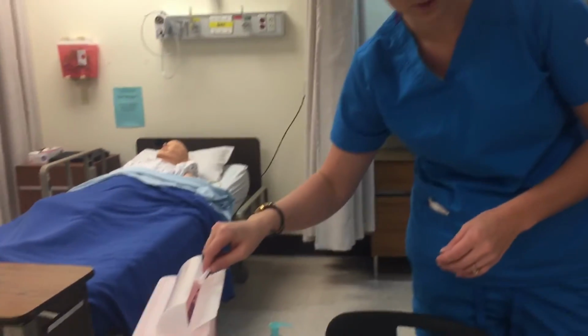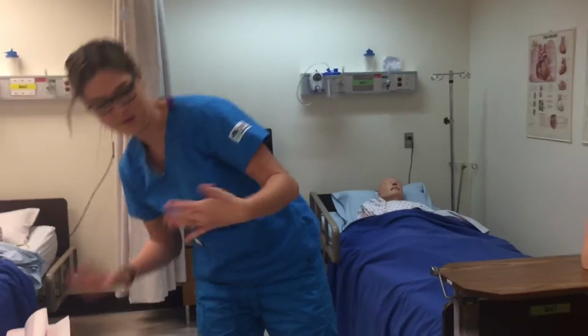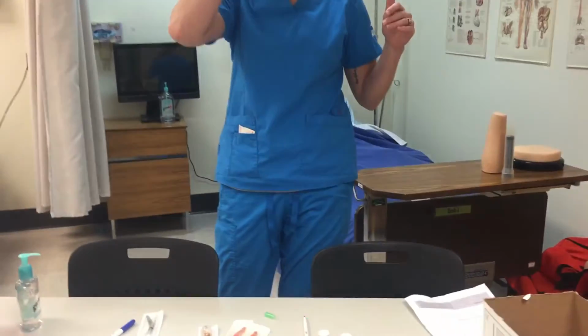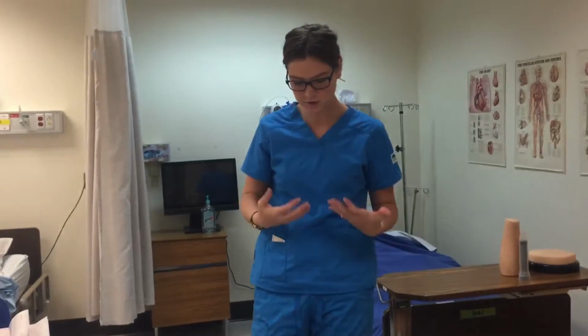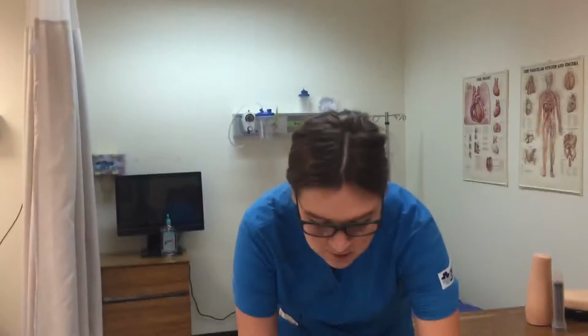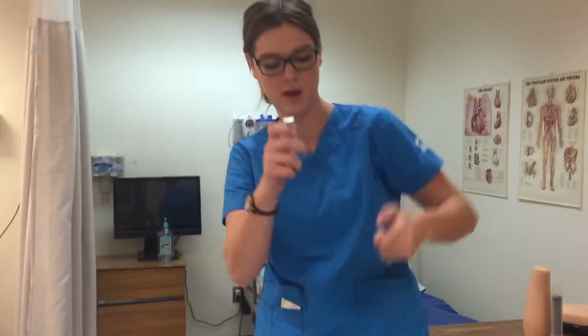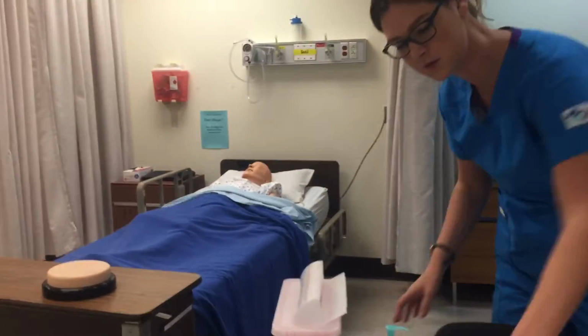Let's put it in the sharps. Okay, so for my next, now I'm back to my patient. I am going to now prepare my influenza vaccine. So the first thing I'm gonna do is I've already checked. I've made sure that this is the correct medication, not expired, and for my patient, I can toss the tops.